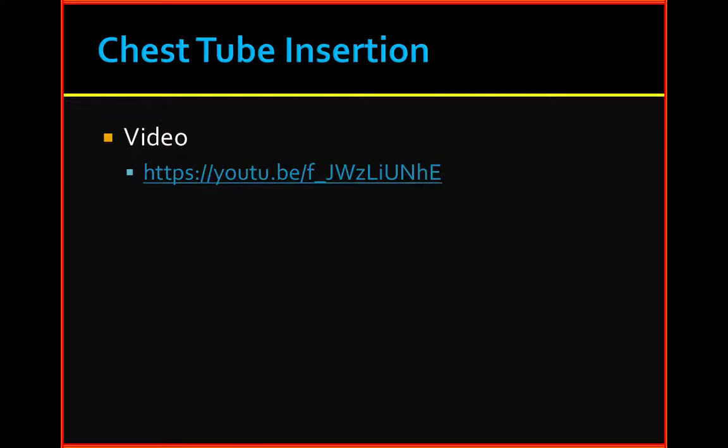Sound technique and safety. Indications: pneumothorax in a patient on positive pressure ventilation, hemothorax, recurrent or symptomatic large pleural effusion, empyema, chylothorax. There are relative contraindications, mainly based on hematologic abnormalities, such as bleeding diatheses or coagulopathy. Blood products or coagulation factors may need to be transfused in order to reduce the risk of bleeding during the procedure. The procedure should be explained and consent obtained whenever possible from the patient or next of kin.